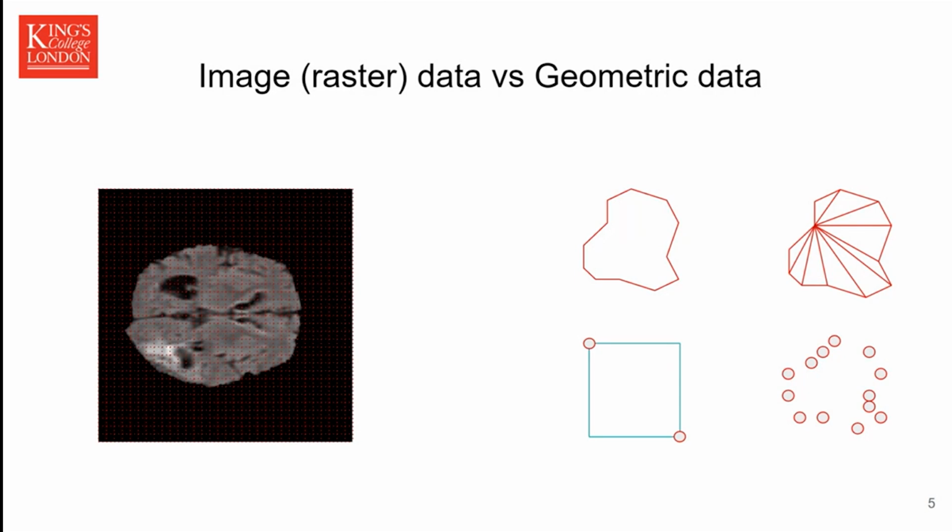These points don't get their own specific position. It's kind of subordinate to the overall position of the image or volume. And so we don't need to provide a coordinate for each of these points. And this is the kind of data that MONAI and various other image processing libraries have provided lots of functionality for over the years.